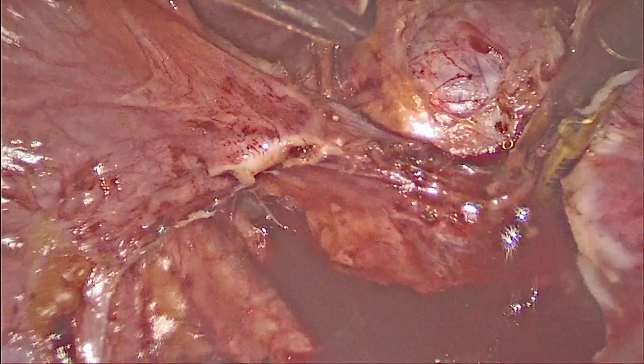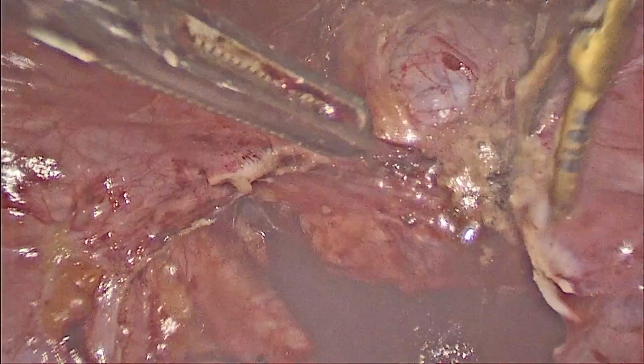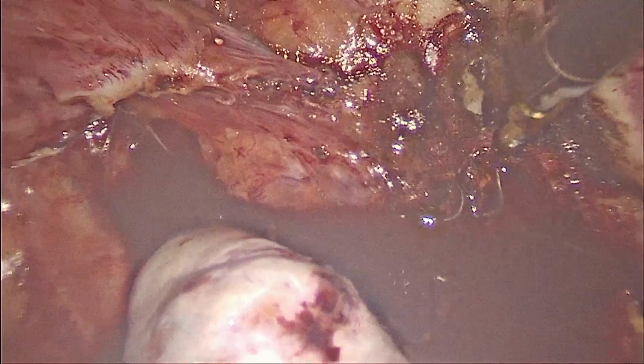So now we are going to the uterine vessels on the left side. Still we can anticipate an adhesion of the rectum to the posterior part of the cervix, which needs to be divided, which we will tackle once we divide the uterine vessels.